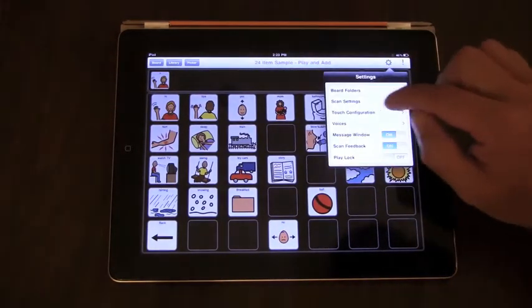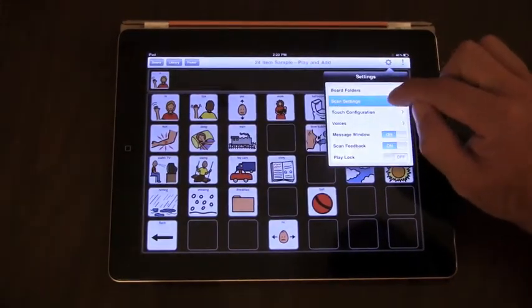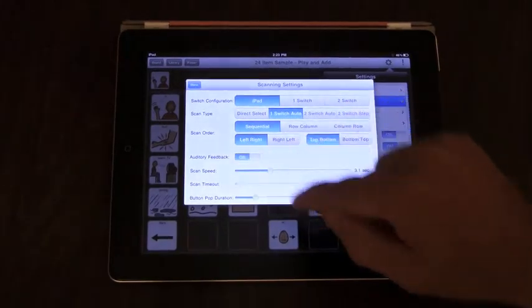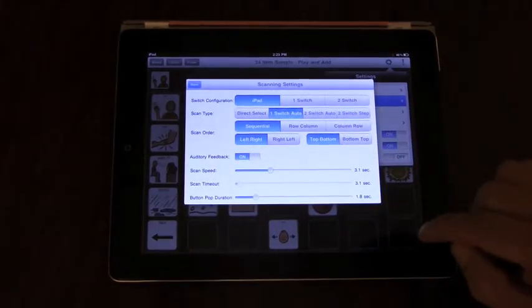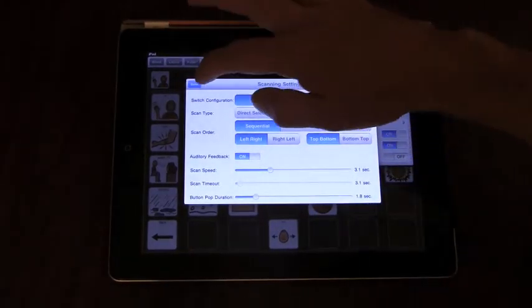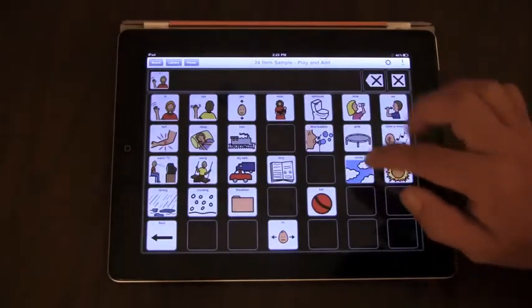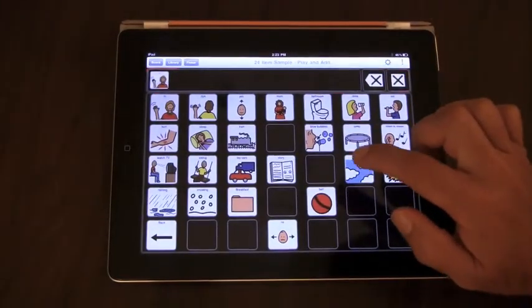And we can have both the clicks and the auditory prompts. It sounds like this.